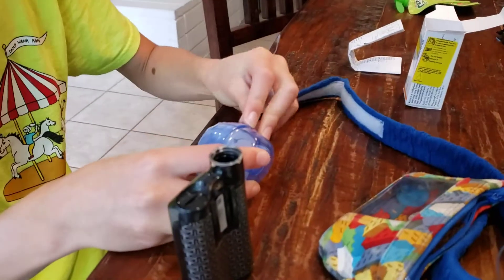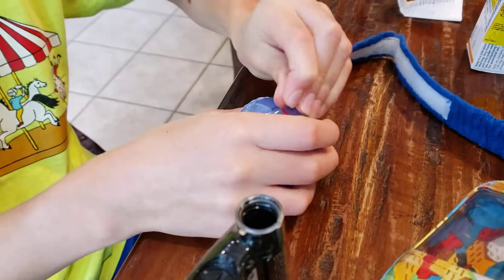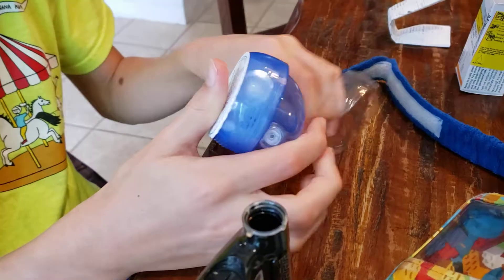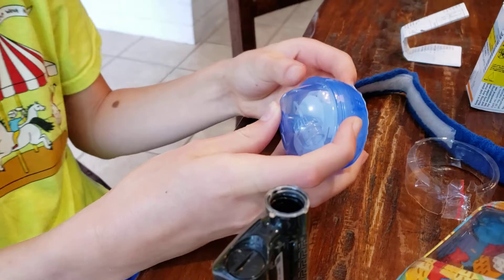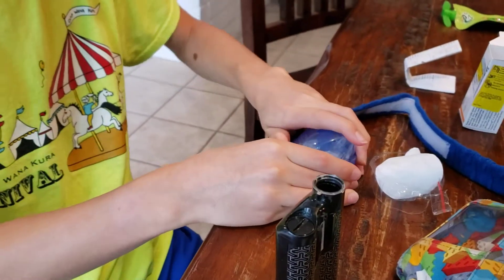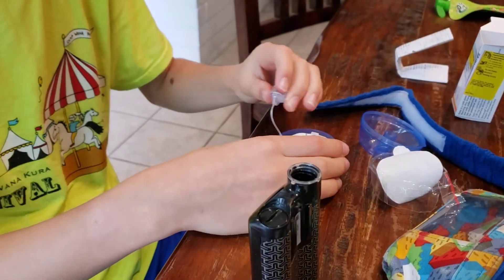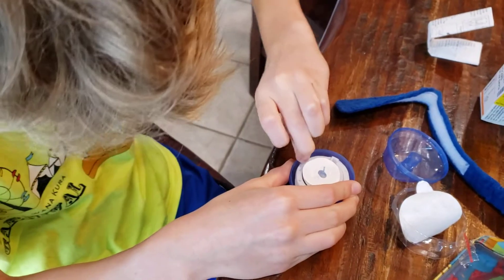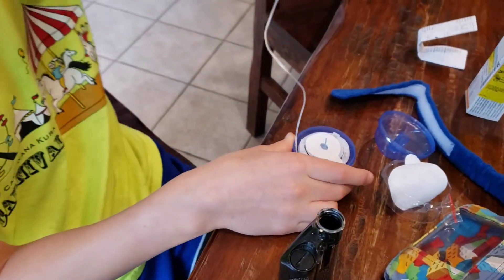Okay, can you show us? So you just have to unwrap it — unwrap it and then take off the wrapping. And then take off the top. There's a little hook so you have to unhook it, and then it will just automatically unwind.